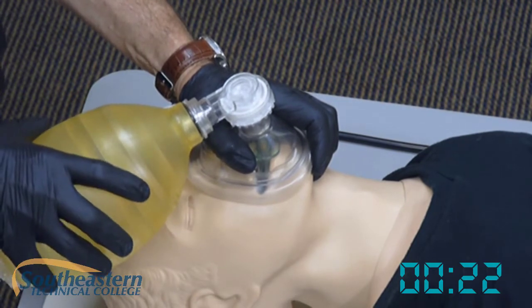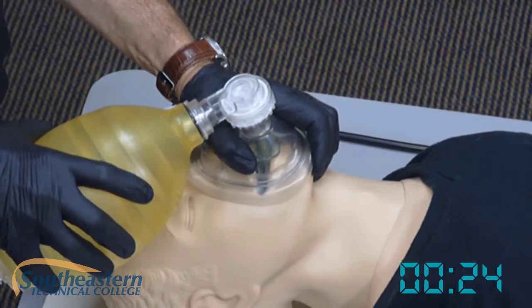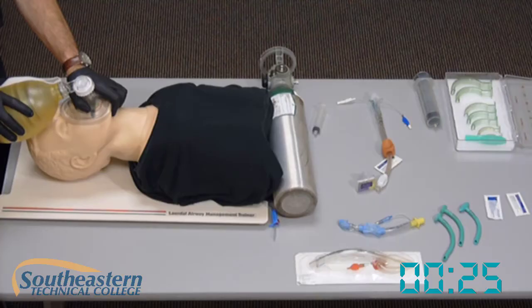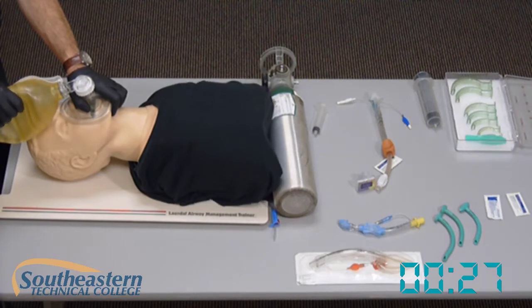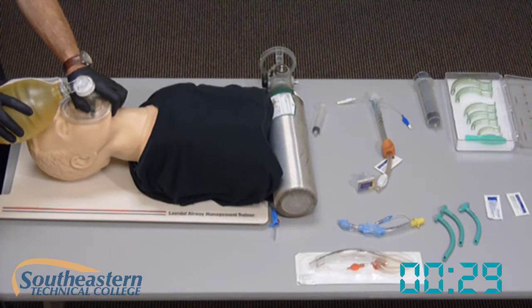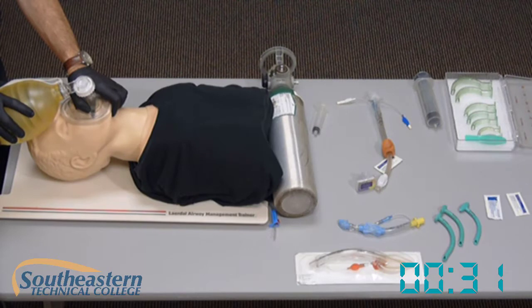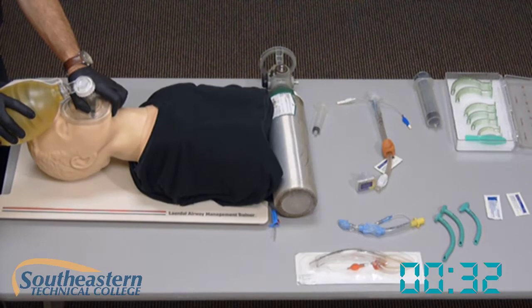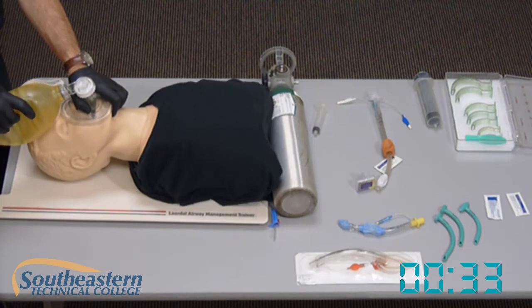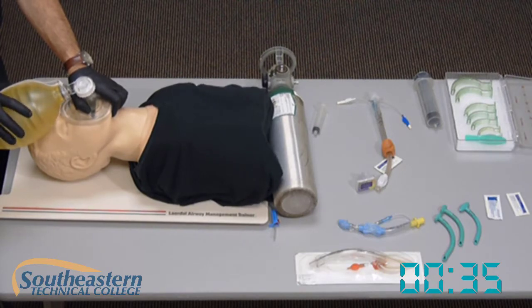I'll be ventilating my patient 10 to 12 times per minute — that'll be once every five to six seconds. No difficulty.